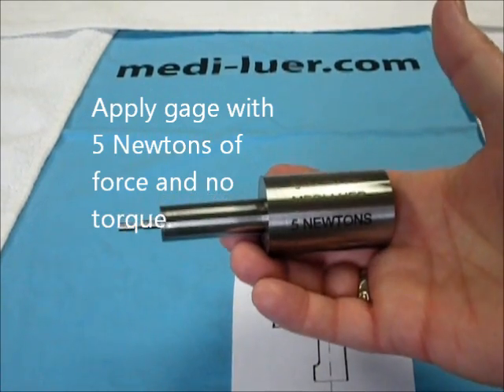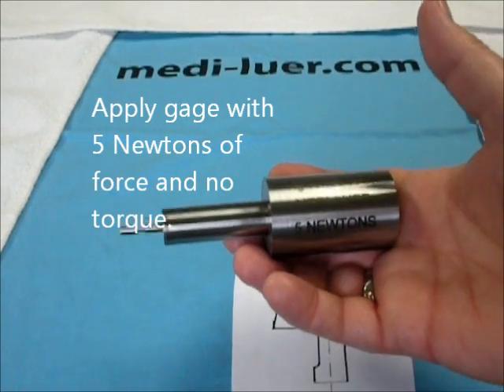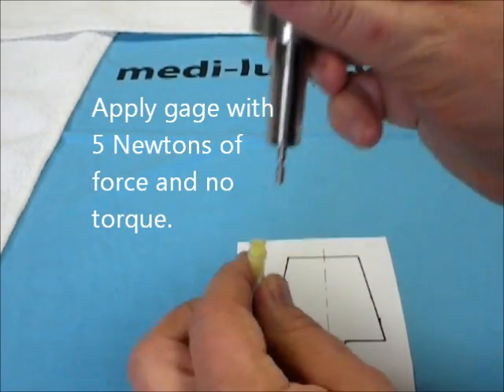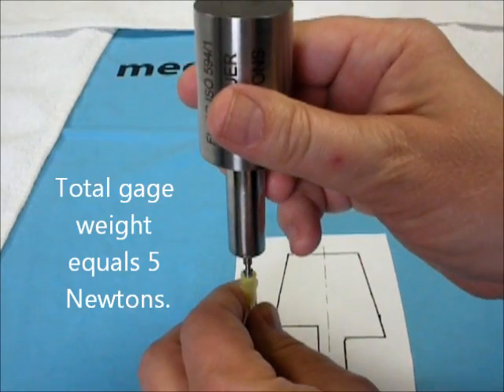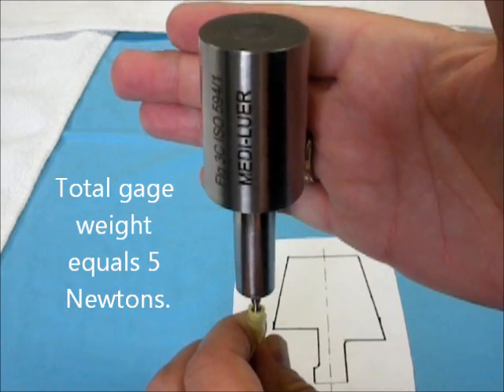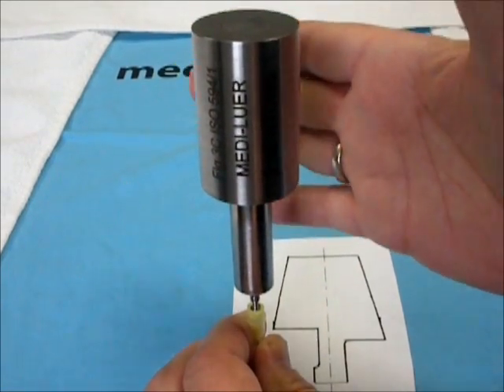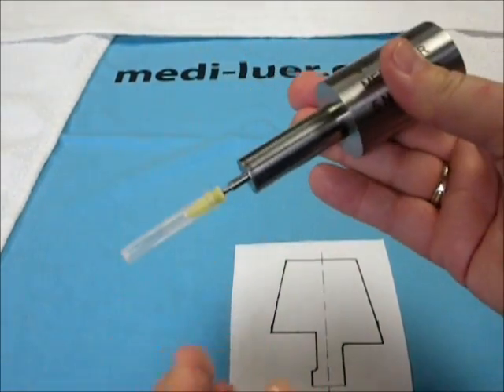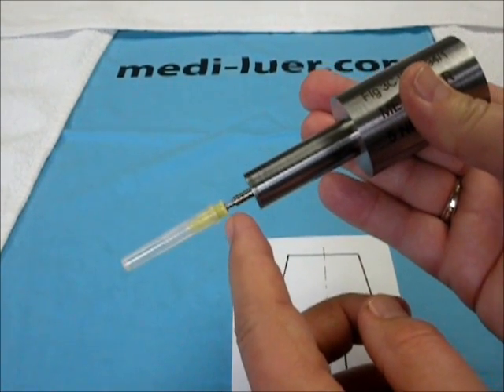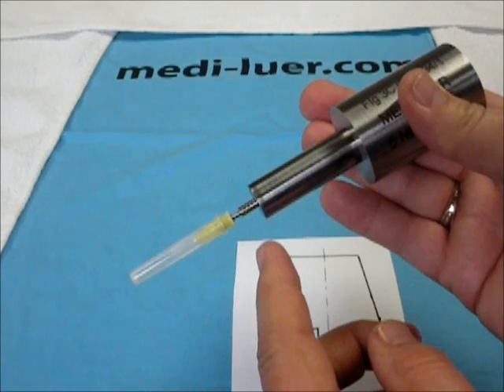This entire assembly is calibrated at 5 newtons. We take the test piece, apply the gauge to it just straight on, allowing gravity to do the work. We do not twist, and it is currently in place. We then read the notch against the edge of the connector to see if it is within tolerance.